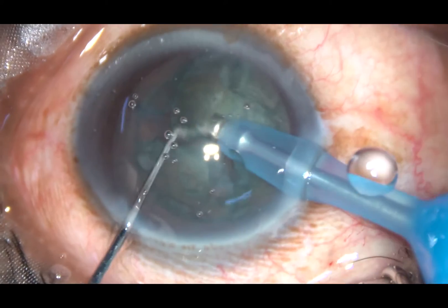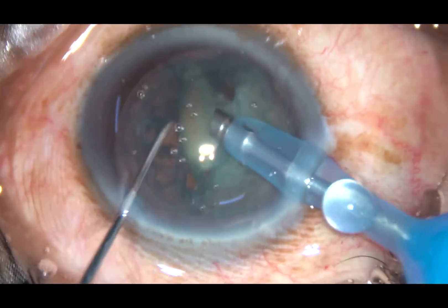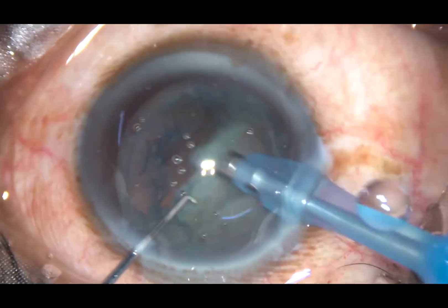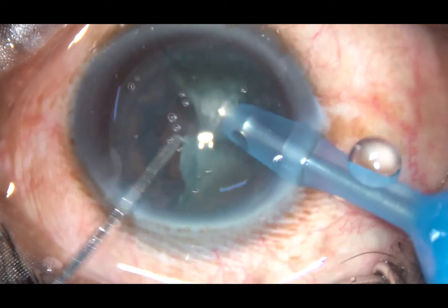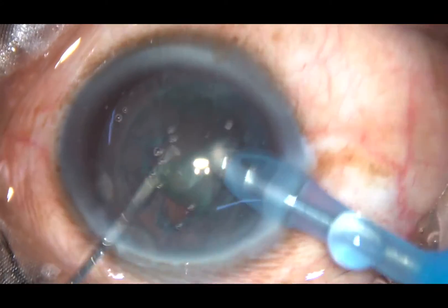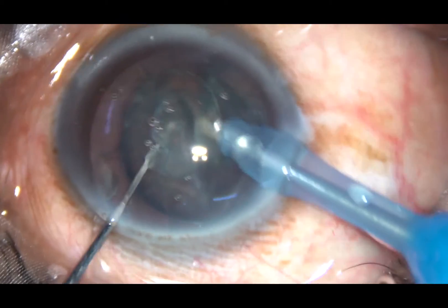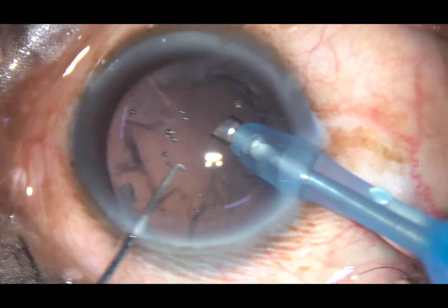This is how beautifully I can chop the nucleus, and the free nuclear fragments are emulsified and removed. The phaco power used in this case is 60%, flow rate is 45, and vacuum is 450 mmHg. This is the Alcon Centurion phacoemulsification machine.